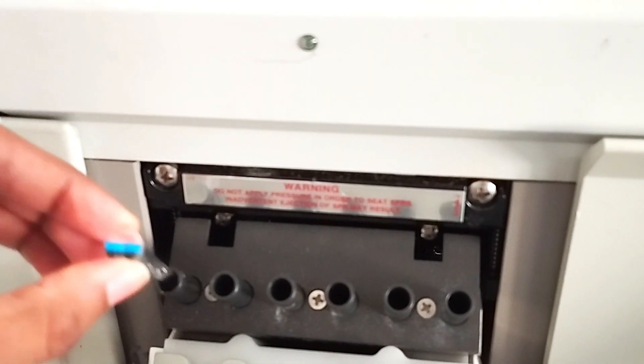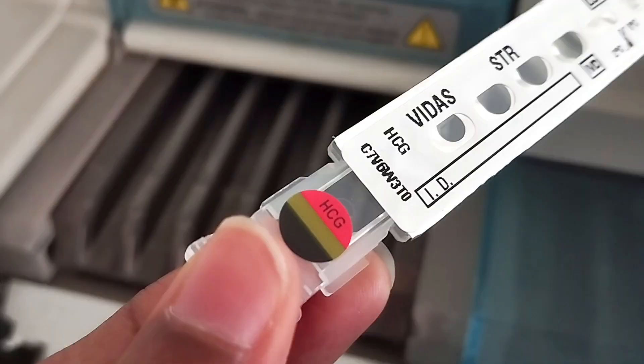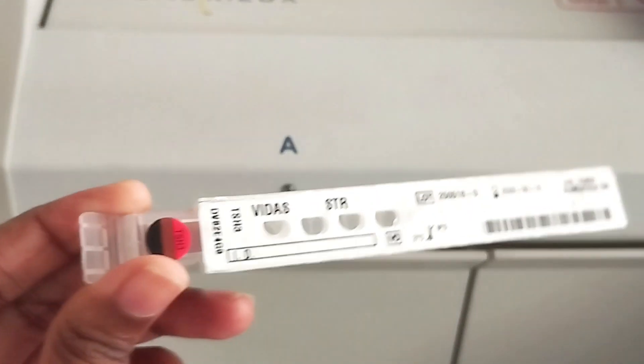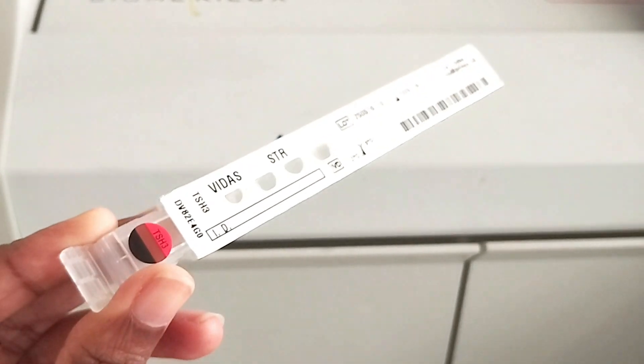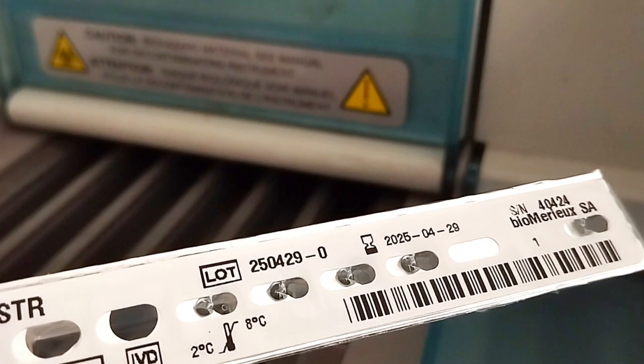Now let's look at a few characteristics of the strips and SPRs before and after use. These are the strips, which are pre-coated with specific antibodies for the target hormones. Before use, they are sterilized and come sealed to prevent contamination. During the test, the machine uses needle-like probes to puncture the sealed compartments of the strip, which allows the analyzer to inject or aspirate liquid into or from the compartments — those are the holes you can now see on screen.